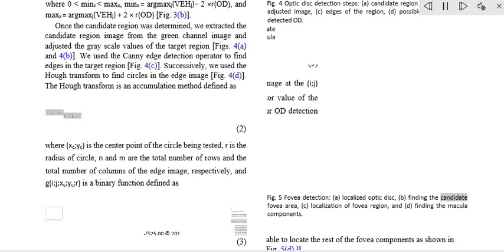Finding a suitable retinal image. In this paper, we propose a method to determine MSRIs that include the OD, fovea, and superior and inferior arcades. MSRIs provide valuable information about the retina and are preferred by ophthalmologists. We call a retinal image an MSRI when it has both the OD and the fovea at a specific location called the expected region of OD, EROD. An example of EROD is depicted in figure 8.